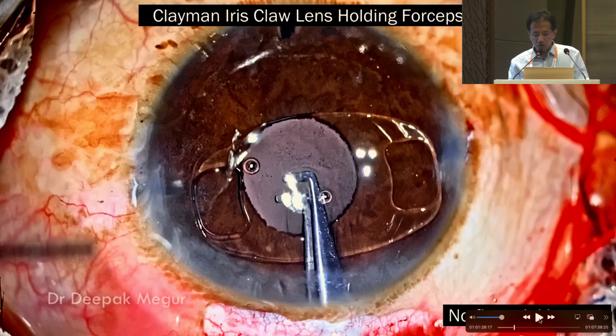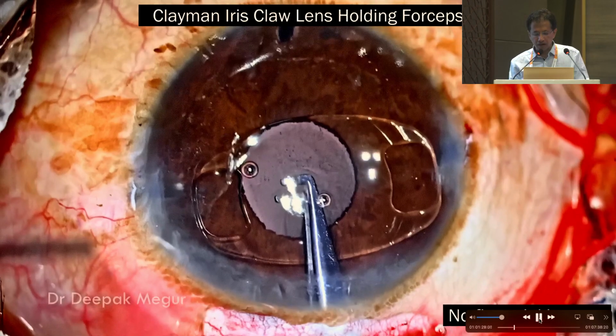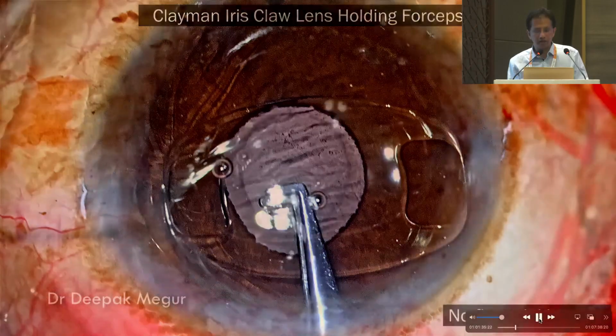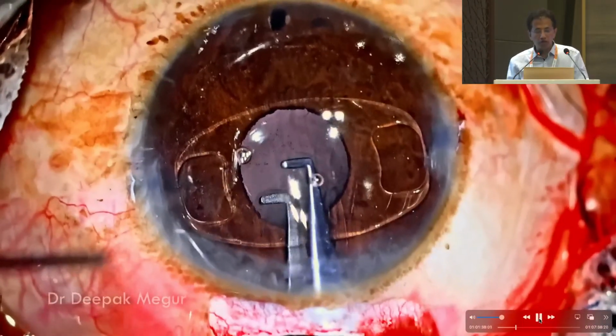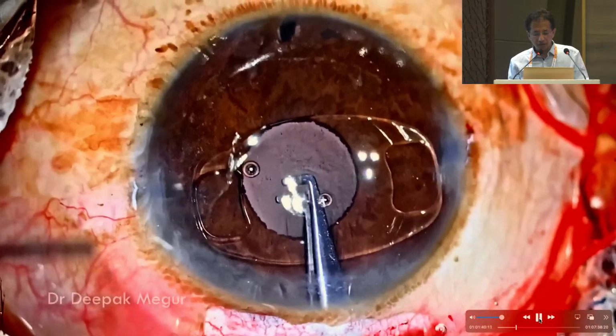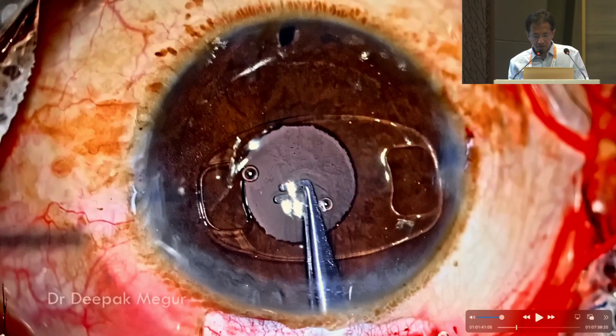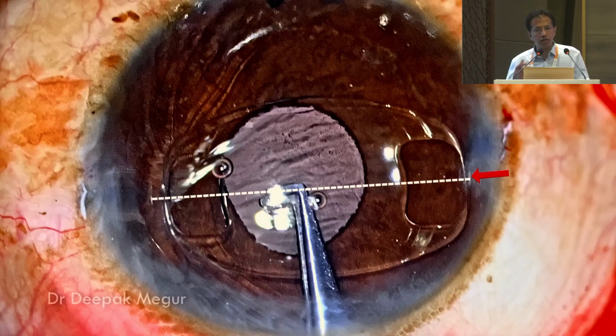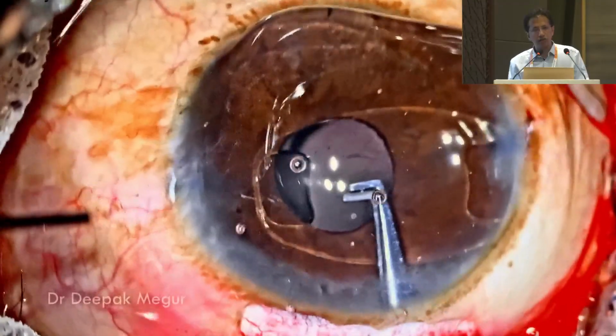What happens when you're using it in a post-vitrectomized eye is that the eye is very soft, so you have a lot of corneal folds which disturb the visualization. So you don't want to create excessive opening of the incision. So just hold it. The position of the hooks of this forceps have to be aligned in such a way that they are just in line with the notches, so that when the notches go inside the iris, we know exactly where the notches are, so that we can press the iris so that the enclavation can happen.